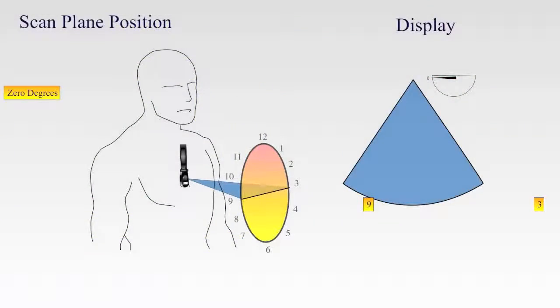We will now examine the standard omniplane angles used to aid in imaging the heart, while using a clock face to help us orient the position. The 0-degree scan plane would cut the clock face across from 9 to 3. With image flip and rotation as described previously, the 9 side will appear to the left of the screen and the 3 side to the right.